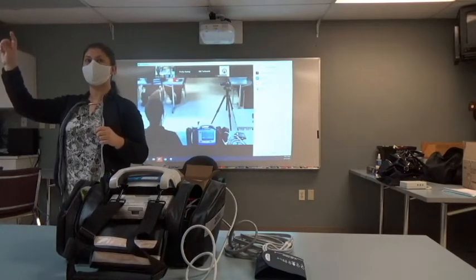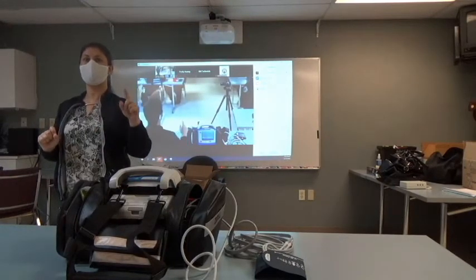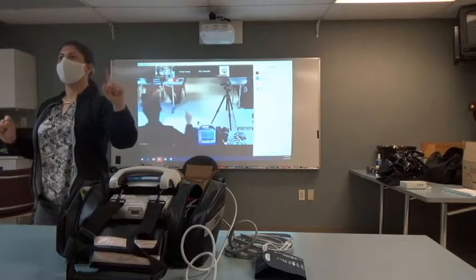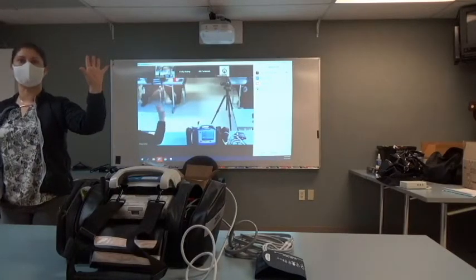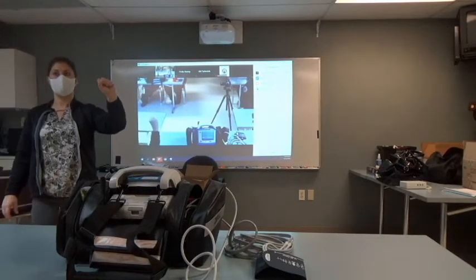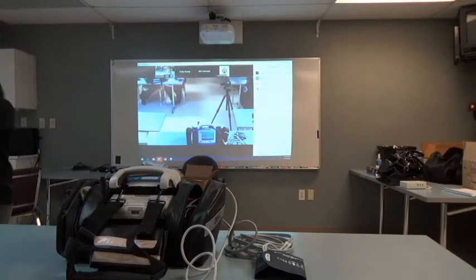So when you guys deliver, you're going to get a different number in green. If you guys can deliver your energy or disarm it, please. Okay. So for those of you that were able to deliver, you asked for 200. You may have seen a different number in green. What did you guys get? 229. 232. 232. Why isn't it listening to us? Did we break it already? We don't have the resistance of a person. No resistance. The resistance, okay.